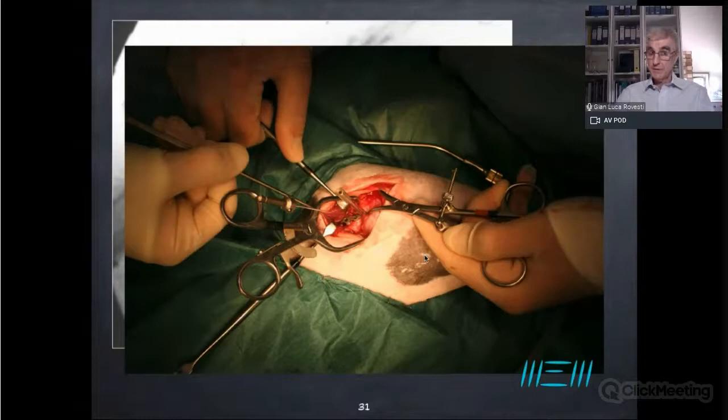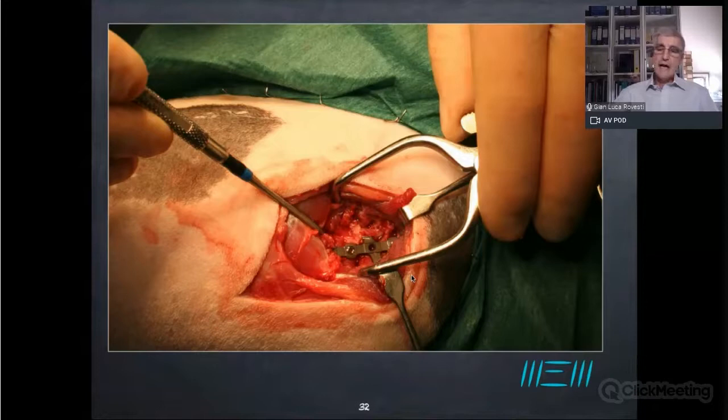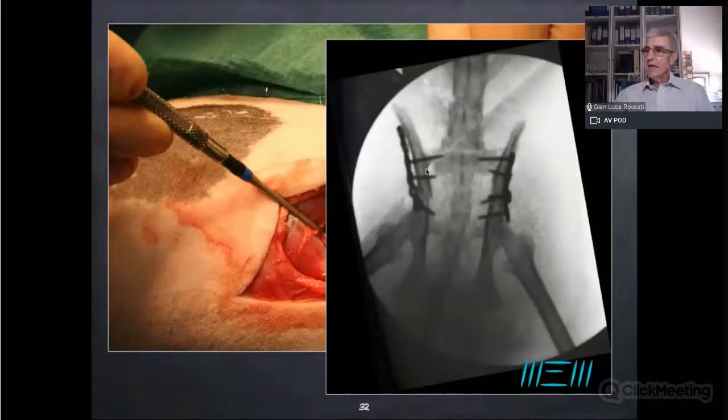So this is stabilization of the left ilial wing, and we use this kind of plate that is a cross plate, so that we can take advantage of multiple points where we can insert the screws. And this was the situation after the first stabilization. So we stabilized the sacroiliac joints like this, and the fractures with the same plate.